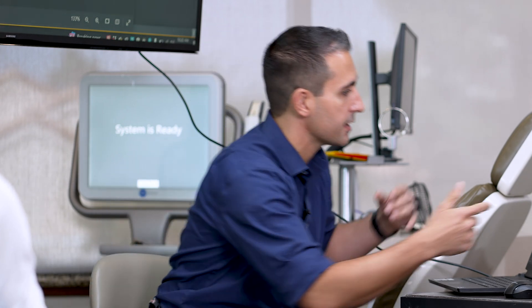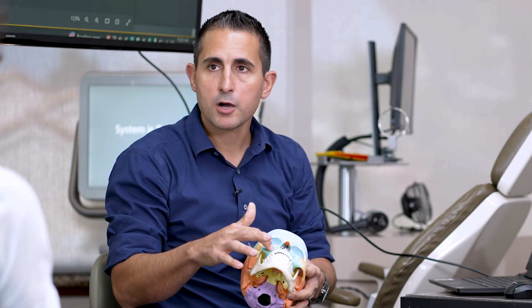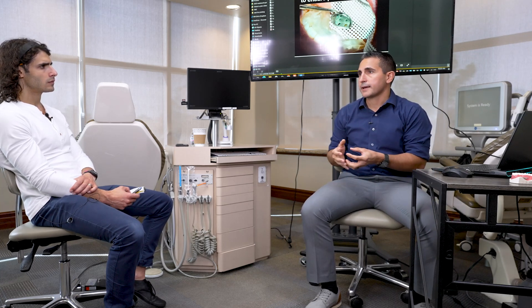Piloting is using some type of drill to create a hole within the cortical bone — that first cortical plate, the hard plate. Looking at a skull like this, all the things you see are cortical bone. The TADs are actually self-tapping screws, designed to puncture through that cortex. But just like a self-tapping sheet metal screw, if you're pushing straight down it works perfect, but if it's at an angle it might slip before it engages.